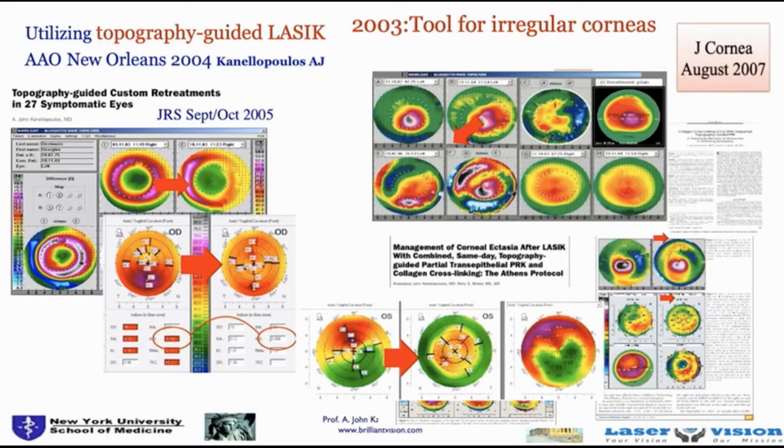And what we're trying to do, who wants to guess what we're trying to do here? This is a 20/20 eye, mild patient. Why do we want to treat him? Absolutely, great, because this patient had significant problems with glare at night. So this is one of the problems with the old technology lasers. Those of you who are familiar with the broad beam lasers, I worked with a Summit laser back in '94 in Europe, and in my training in Boston, I got certified on that laser in, it was '96, if I'm not mistaken. And the effective optical zone was 4.5 millimeters.